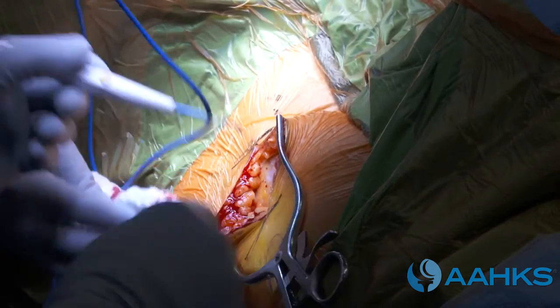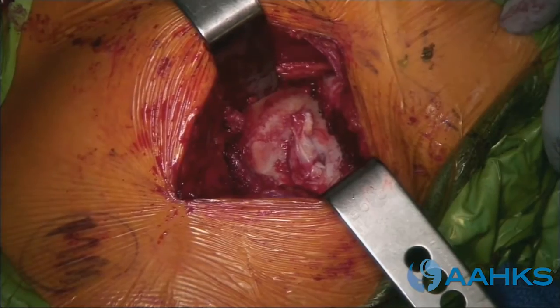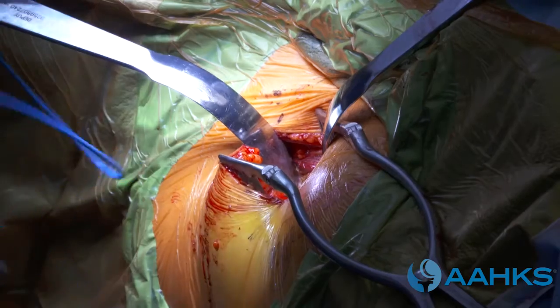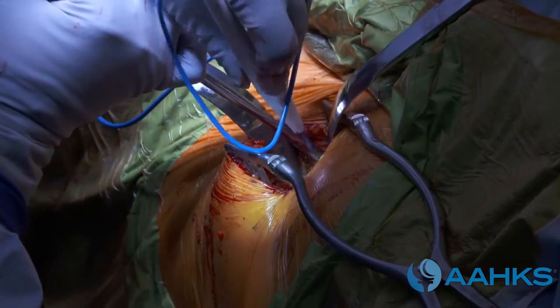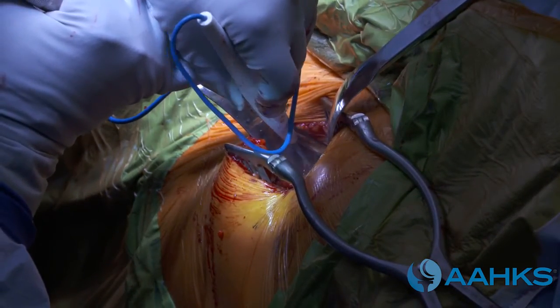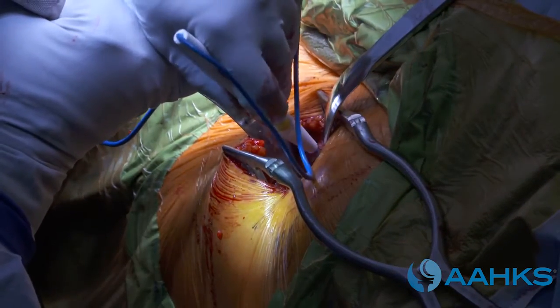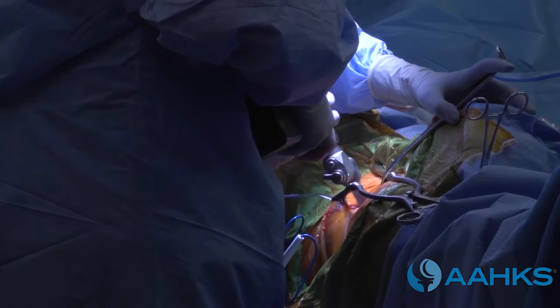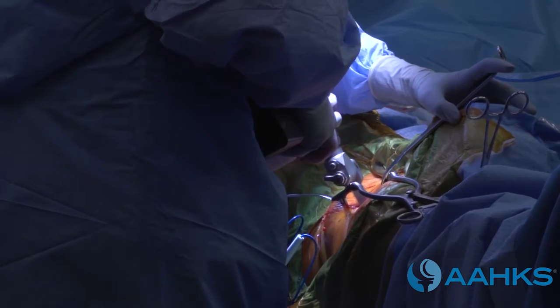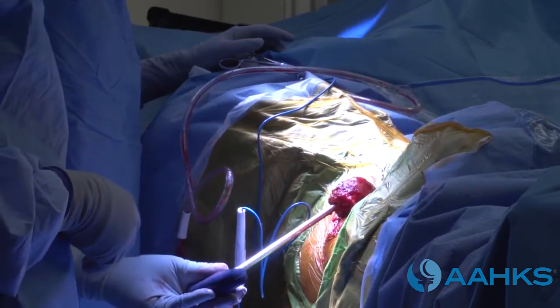After the skin incision is made, deeper incisions are made using a cauterizing scalpel to minimize blood loss. Once the joint is exposed, your surgeon will prepare for implants. Retractors are used to keep the surgical site open and aid in moving around the inside of the hip. The surgeon separates the hip joint in order to access the thigh bone, the femur, and the hip socket, the acetabulum. A special surgical saw is used to cut the head of the arthritic femur away. It is carefully removed so as not to damage tissue.